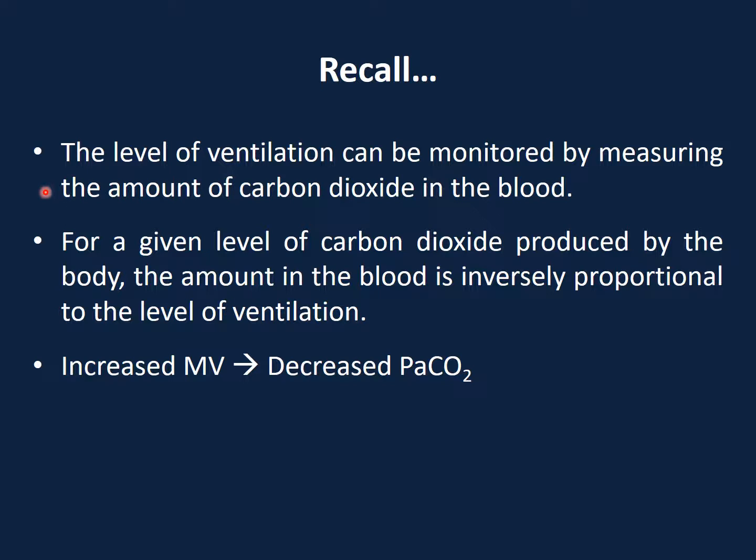Now, because that can be very expensive and time consuming, and ABGs only tell you about the level of ventilation at that snapshot of time, something was created to monitor carbon dioxide in the breath on a breath by breath basis, right? So that's called capnography.